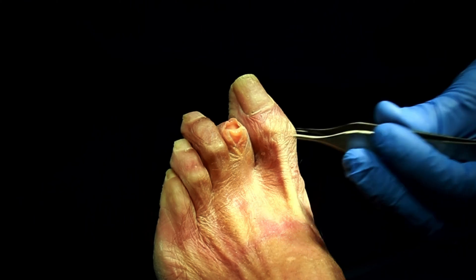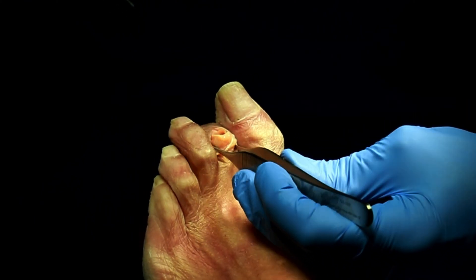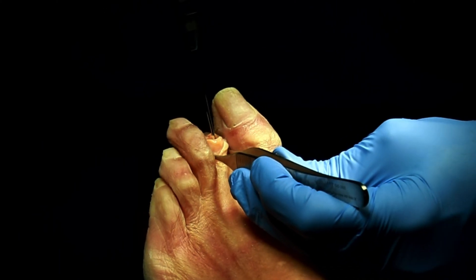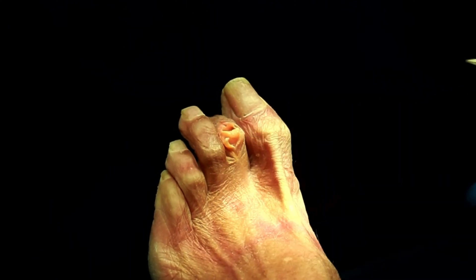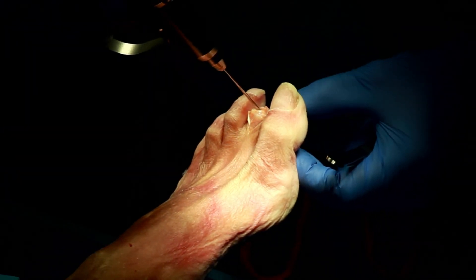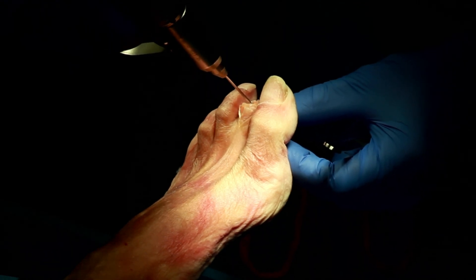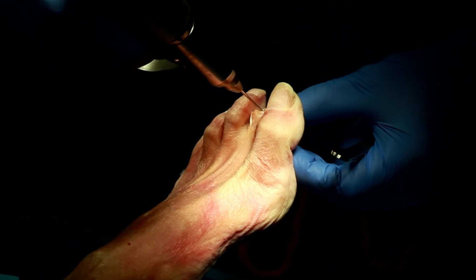Holding the proximal phalanx in place with a forcep to stabilize it is important. You'll start your hole a little bit anterior, spin it to drill, and then allow it to drive down — that's your drill hole. The second drill hole is in the middle phalanx, and you want to keep the distal DIP joint extended during that procedure.